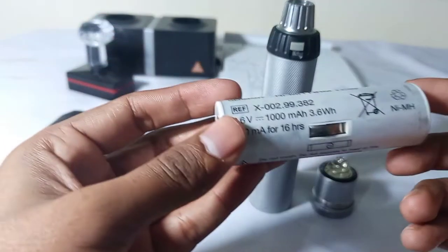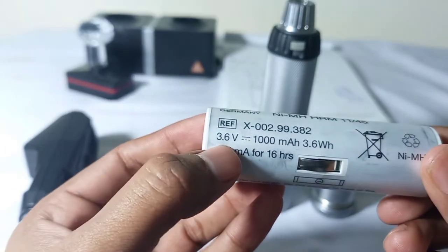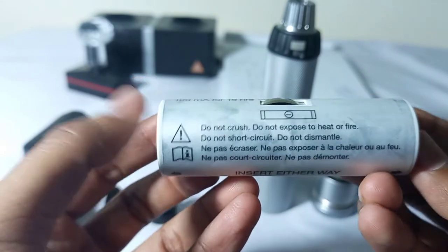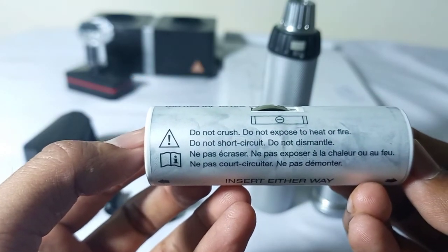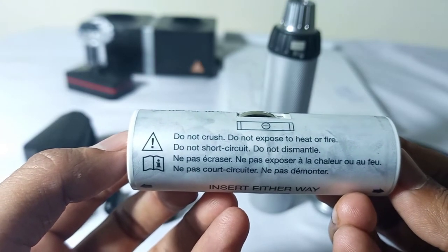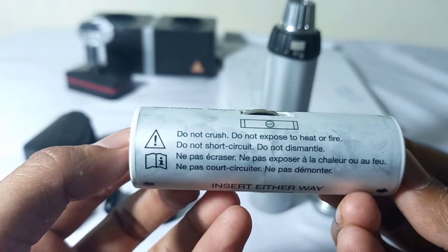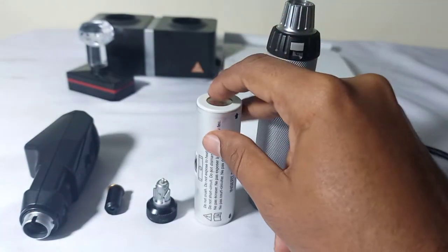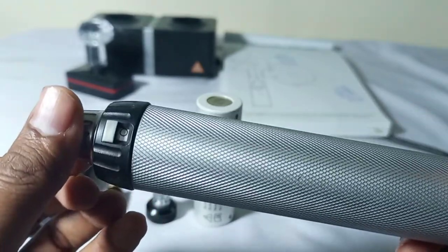First of all we have the rechargeable battery. You can see the power of the battery. You have to read the instructions first — you cannot crush it, you cannot expose it to heat or fire, and do not short circuit it. And then we have the handle of the retinoscope.